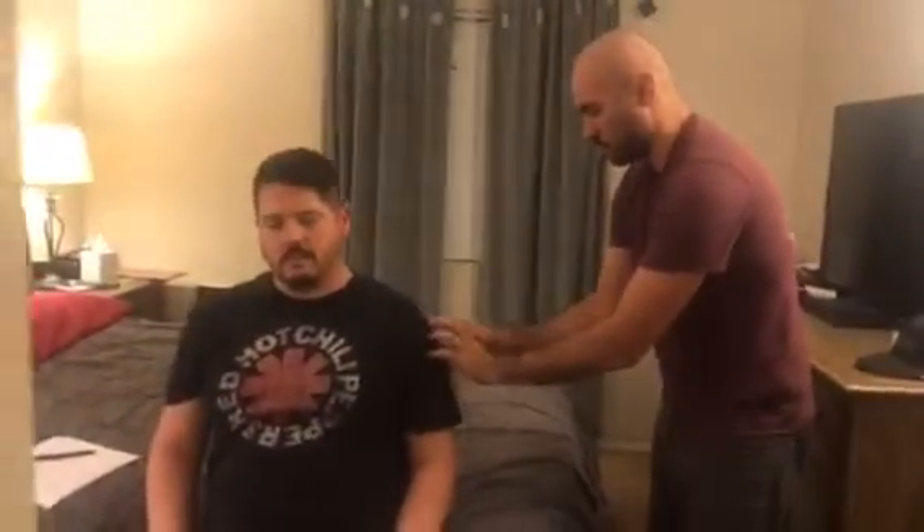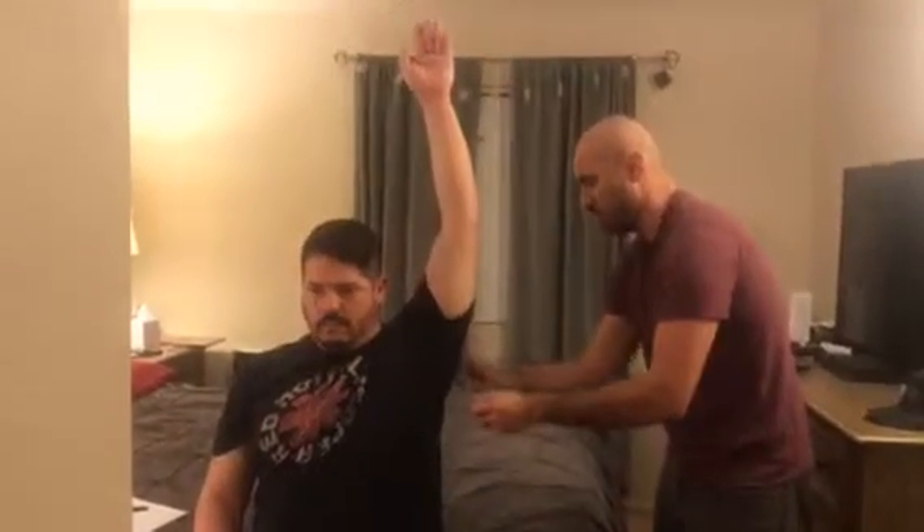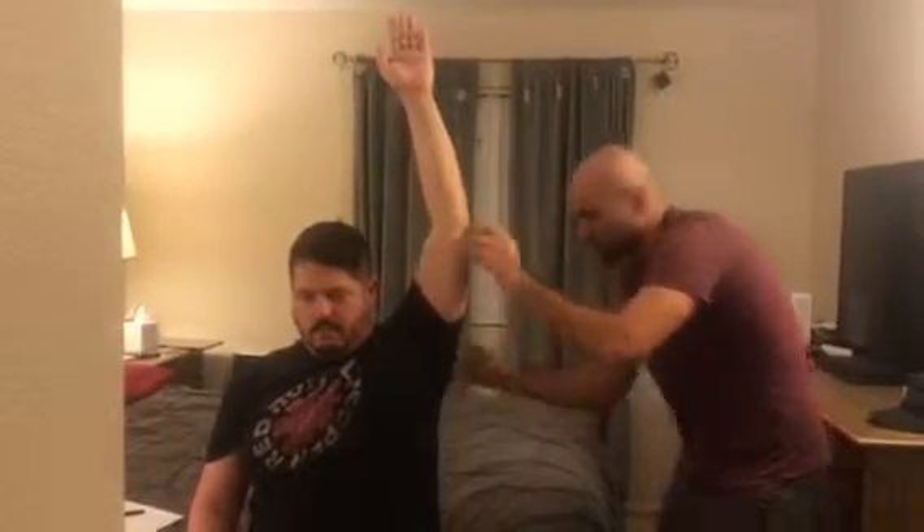We're going to do the same thing for your left. Fulcrum right at the acromion process, have the stationary stick down, go ahead and lift up. This one's a little higher, so it's going to be about 179.